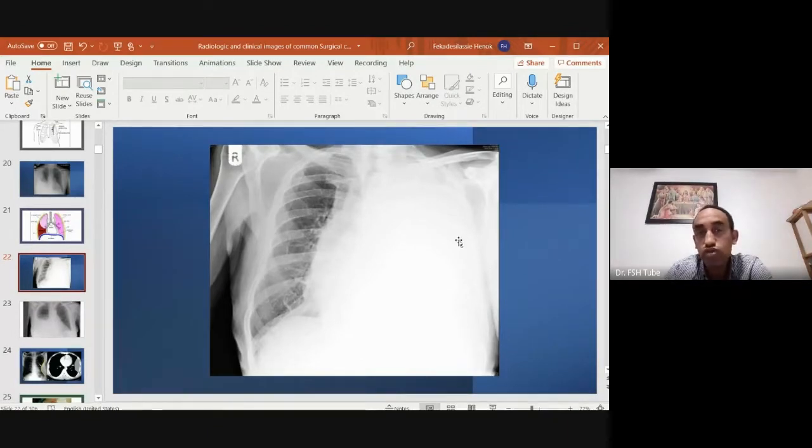Post-pneumonectomy changes, you said it, can happen like that. Consolidation, yes, it could be diffuse consolidation. With consolidation, somehow we may see some air in the background. Here it's completely white, completely white, and some fluid is collecting, so it's less likely to be consolidation. What else could it be? Could it be a mass lesion? Yes, it could be a malignant lesion sitting in there. So malignancy could be there.